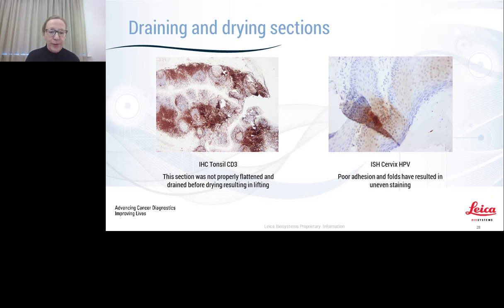So again, some examples here. You can see IHC done on a tonsil for the antibody CD3. It wasn't properly flattened and drained before drying, so it resulted in lifting and therefore a distorted staining pattern. Also lifting, poor adhesion and folds have resulted in almost impossible to diagnose tissue staining.